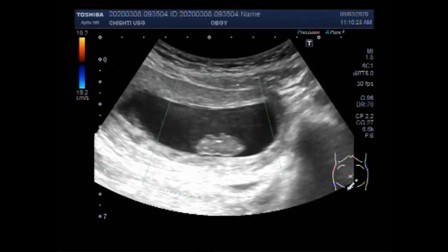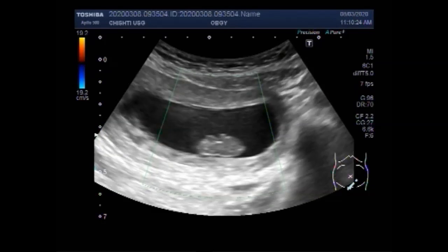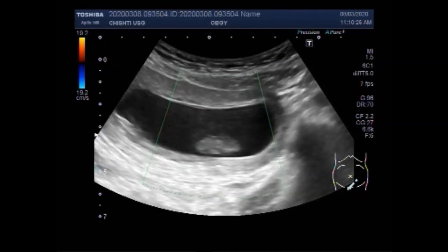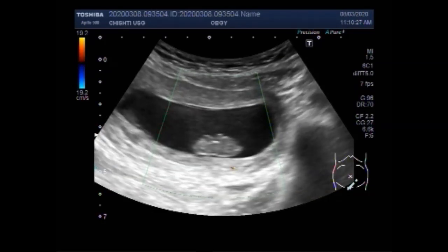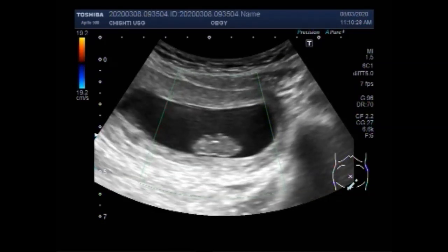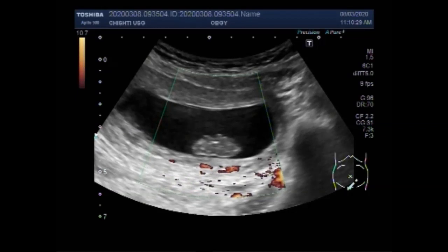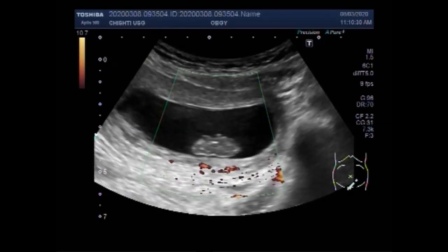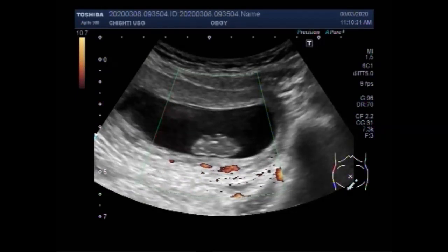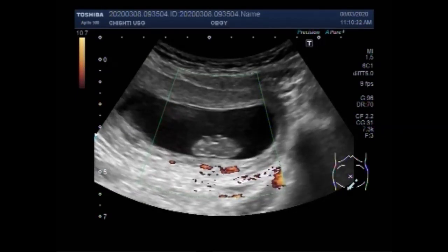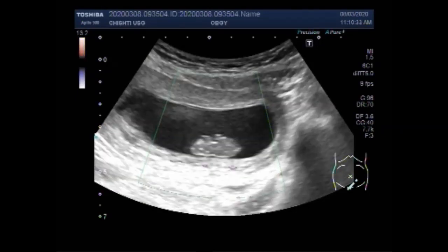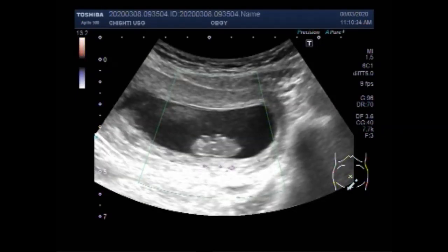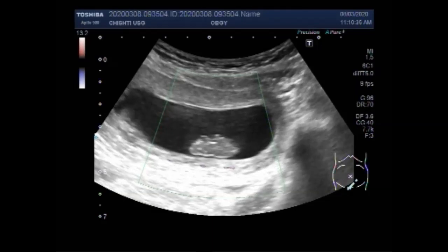You can see there is no blood flow seen in the fetus. No blood flow is seen in the gestational sac either.